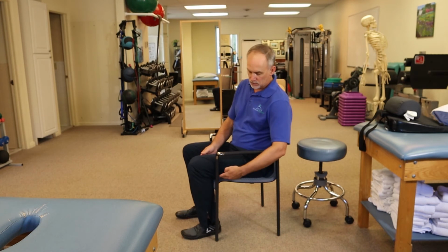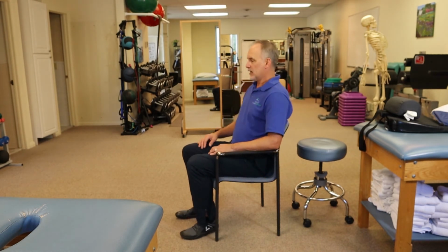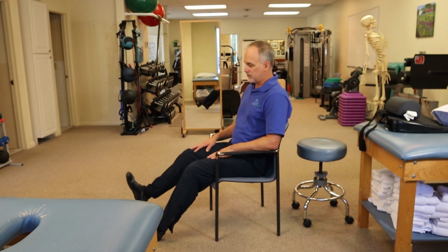Preferably, you want your legs in contact with the chair you're on. You don't want to be dangling. And also, when your legs are outstretched, you'll find it's even harder on this roll. In fact, you'll feel the roll has to work harder to keep you here, because as you straighten out your legs, it tends to flatten the back. So that's why driving is typically a little harder if you're coming off an episode of back pain. So consider some of those things in using the lumbar roll.